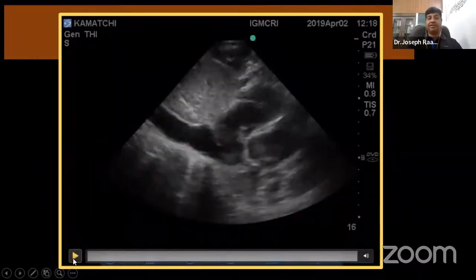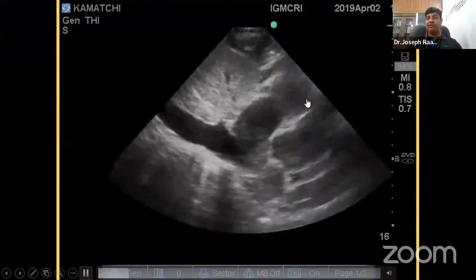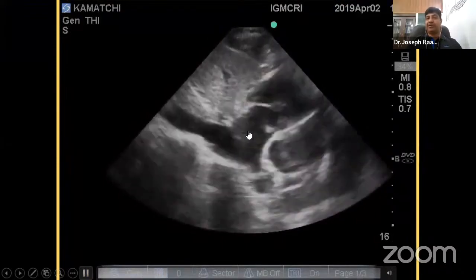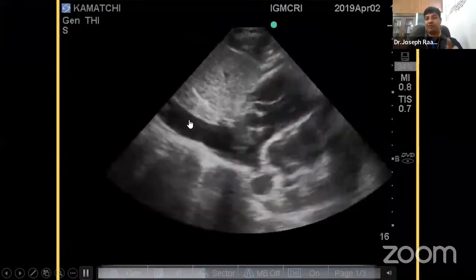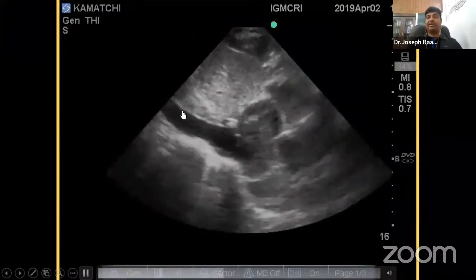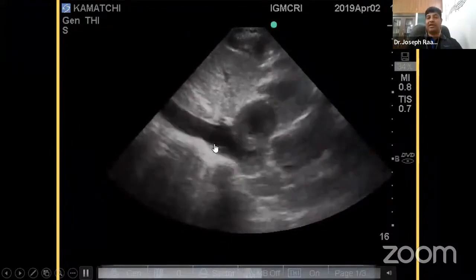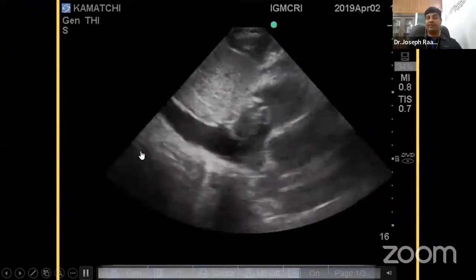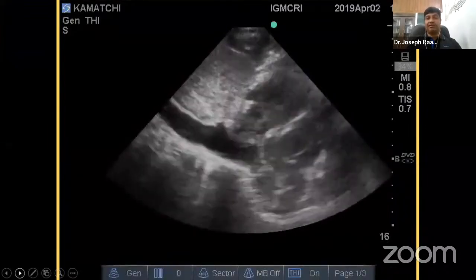Whenever the patient's RV is dilated, with RV failure, the pressure is very high. It is transmitted back to the circulation, and you'll have a plethoric IVC. That's what we wanted to confirm. At the same time, we found one of the clots sitting here and trying to get into the circulation. So this clearly proves the diagnosis of pulmonary embolism. That's about one case.